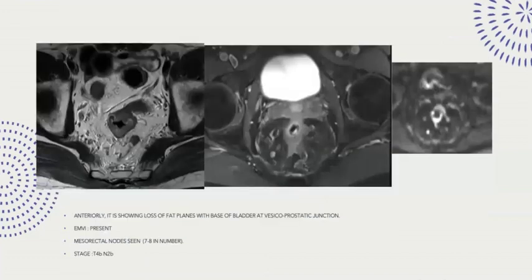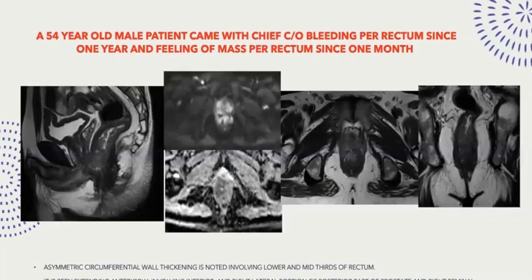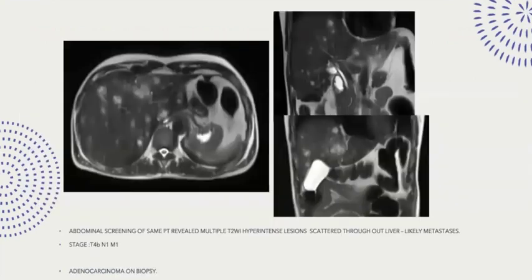Anteriorly, there is also loss of fat planes with the base of the bladder at the vesico-prostatic junction. A 54-year-old male patient presented with bleeding per rectum since one year and a prolapsing mass per rectum since one month. An asymmetric circumferential wall thickening is noted involving the lower and mid-thirds of the rectum, extending anteriorly and involving the inferior and right lateral portion of the posterior part of the prostate and right seminal vesicles. Abdominal screening reveals multiple T2 hyperintense lesions scattered throughout the liver, likely metastases. It is staged as T4B N1 M1.